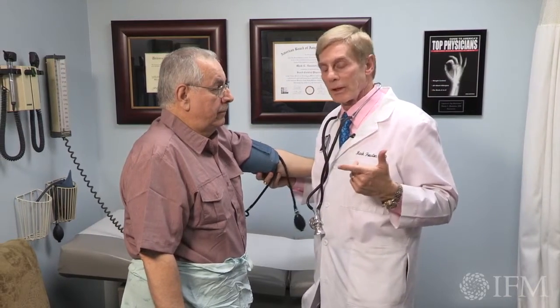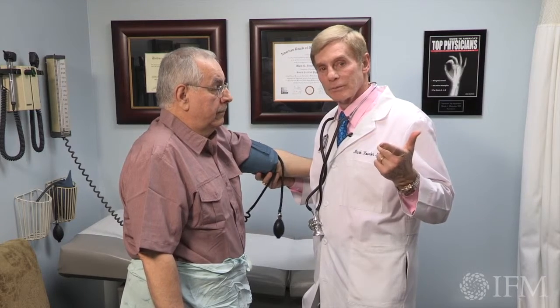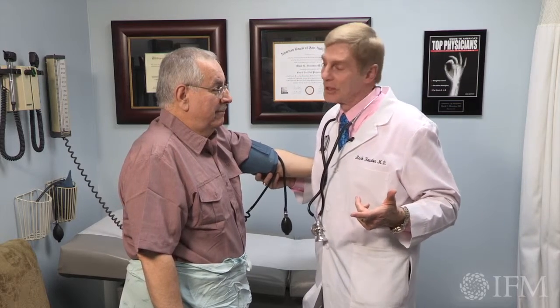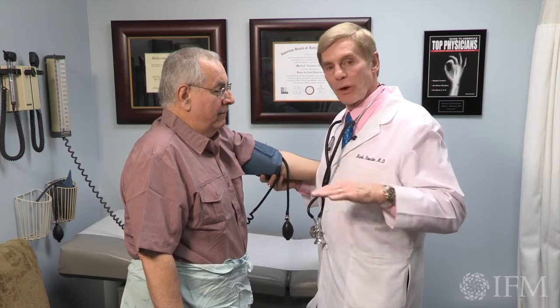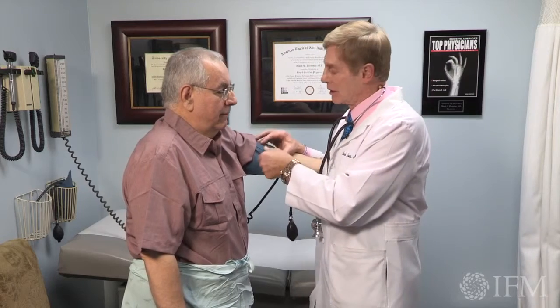One other thing I want to mention: you notice I tell him to close his eyes and breathe rhythmically. If the patient has any visual stimulation, it will increase their blood pressure. If they're talking, it will increase their blood pressure. If they're thinking, it will increase their blood pressure. So you tell him to rhythmically breathe — it activates the parasympathetic tone better and gives you a more accurate reflection of the pressure. But if their mind's going 100 miles an hour, you're going to get some differences.